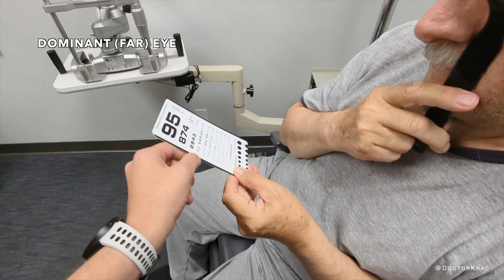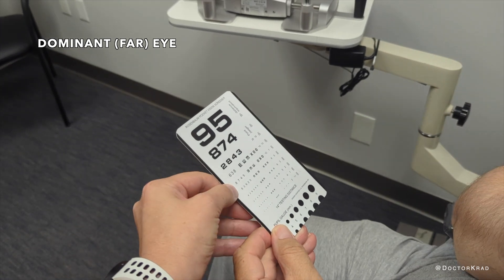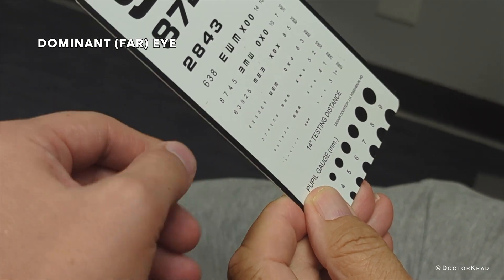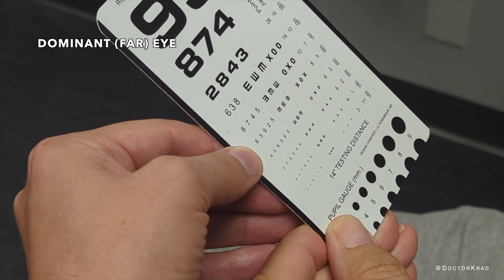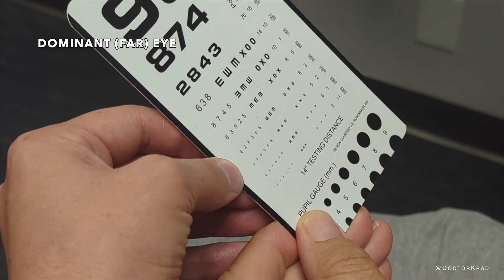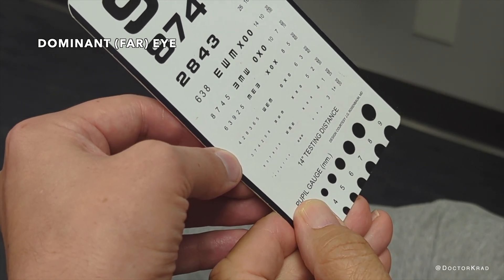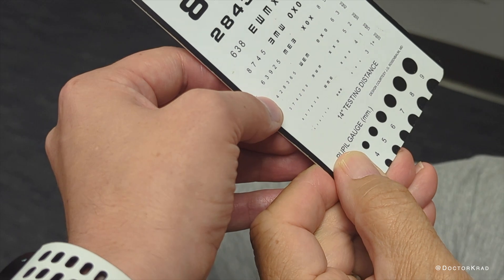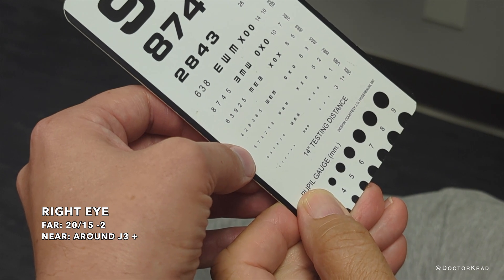I want you to read this line here. 8-7-4-5. Good. How about here? 6 or 8. 6-3-5-9 to 5. Any of these? 4-2-6. 3-6-5. So that's pretty good. Any of these? I think first is 3. 7-4-2-5-6-4-8. The right eye is your dominant eye without the epiretinal membrane.